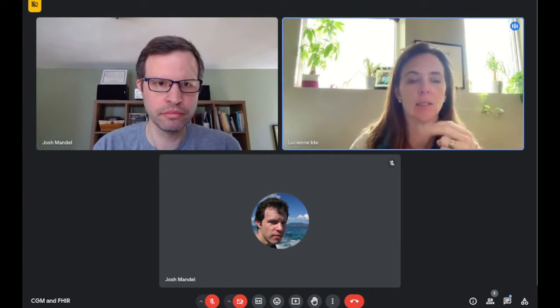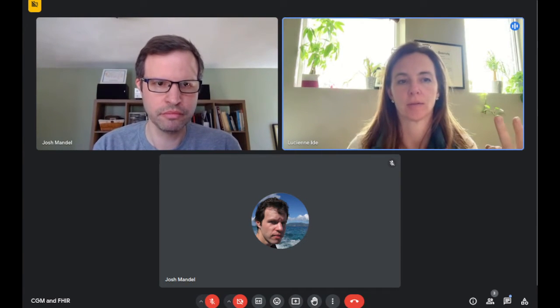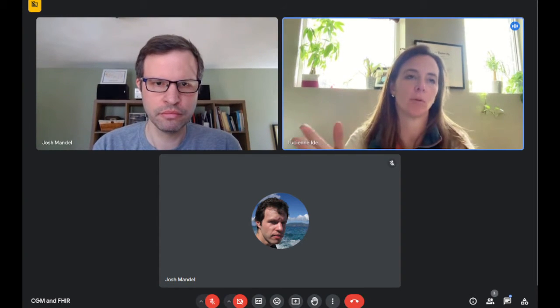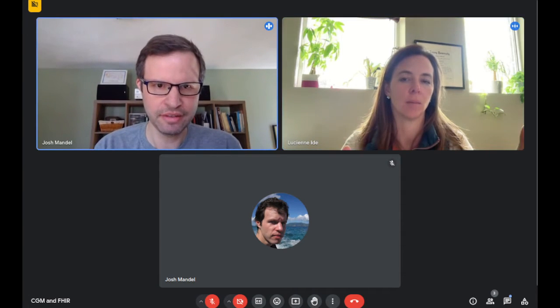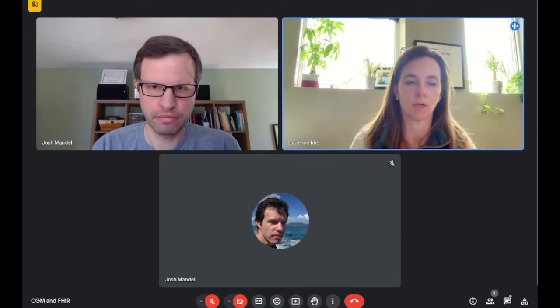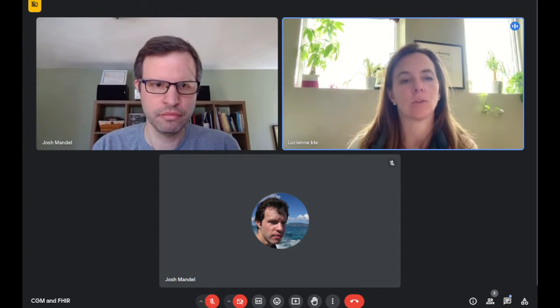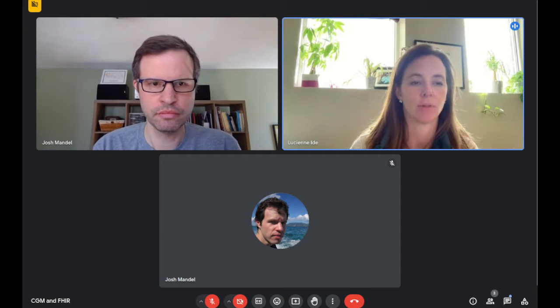Awesome. And so that's one common endpoint. A second is what people will refer to as glucose metrics, which are really, so an AGP report, the other thing defined by the practice guidelines is that it is a 2-week report of data. And so then the summary statistics in that are 2-week averages of the percent time that a patient's spending in range. So we get that discrete data as well. Those, average for the last 2 weeks.